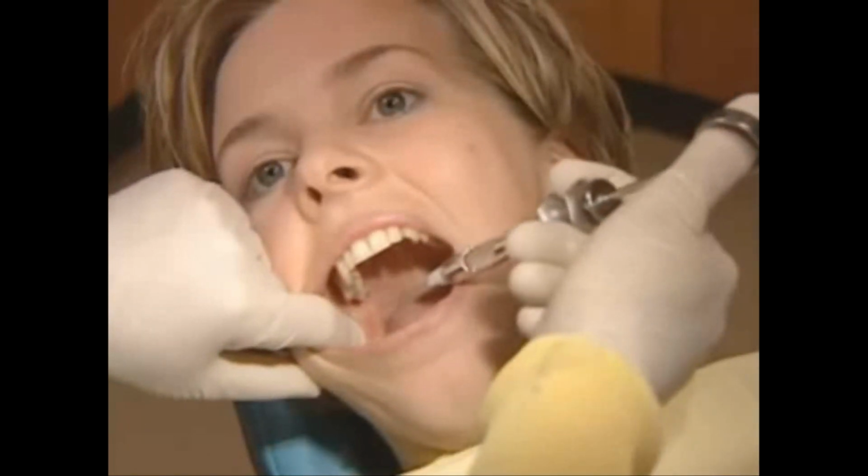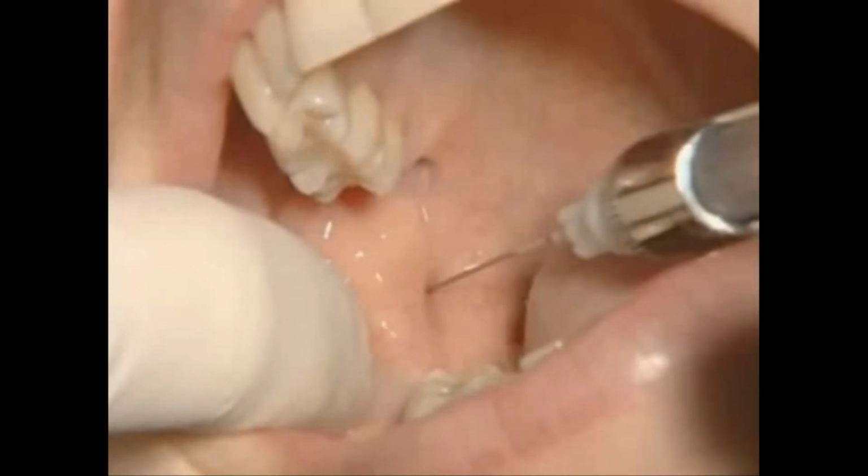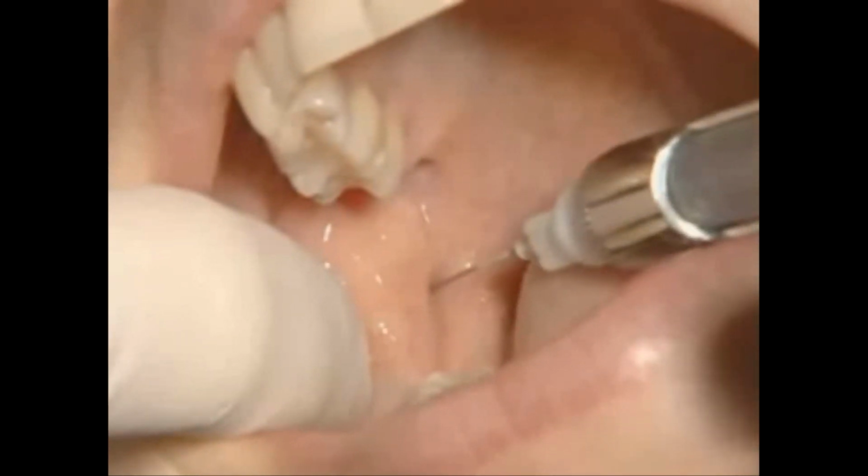After palpating the landmarks, you will be inserting the needle into the pterygotemporal depression. The needle is brought in from the contralateral side, and the insertion point is directly there, and advance slowly until you go 25 millimeters.